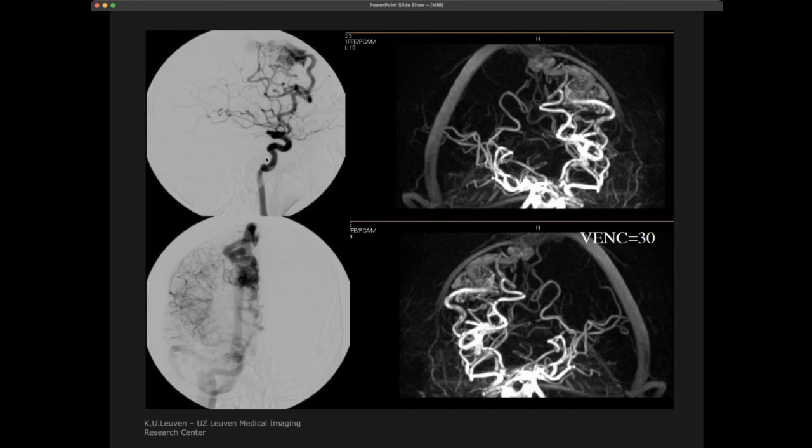But you also see the difference now already. While you see the large vessels with the MRI, you see it very well. The very small ones that you see with X-ray imaging, you cannot see because of the resolution. But this patient here, when you look at it, what you see here is you see this blob of contrast. This is actually an abnormality of the vessels. So this is like an abnormal growth of the vessels, but you can see that nicely in the MRI.